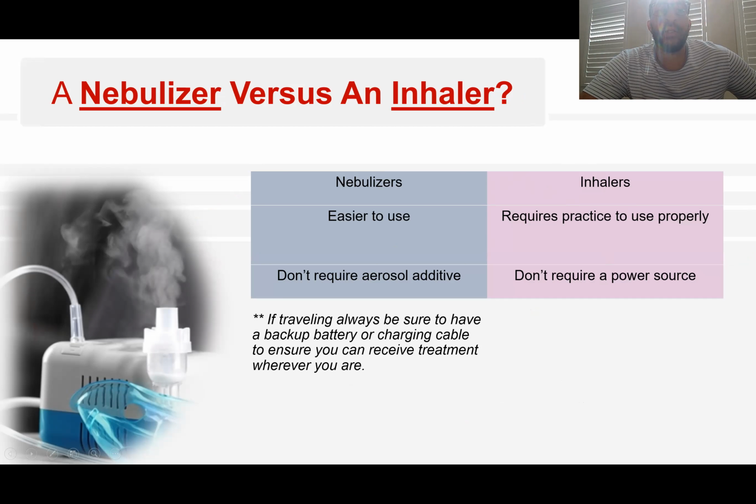They have to practice in order to get more and more efficient with it: the timing, the breath, the inhalation of the medication, to get things correct. Whereas with a nebulizer, you just put the mask on or you just give them the mouthpiece and they're done. Come back in 20 minutes.